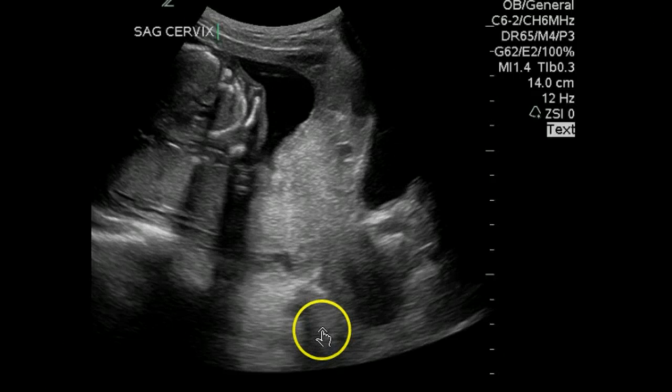Okay, we're going to review this ultrasound. We're starting out with a sagittal view of the cervix. And the first thing we can notice is that there is a lot of tissue overlying what I would assume is the cervix right here. We do see this little V-shaped area, which is going to suggest to me that this is probably going to be a lower uterine segment contraction.